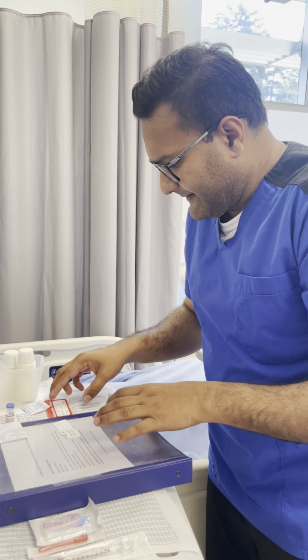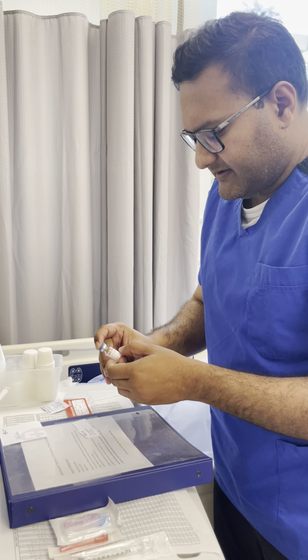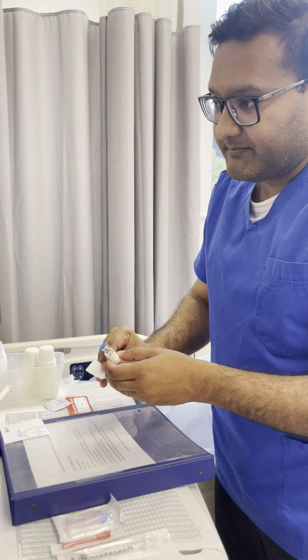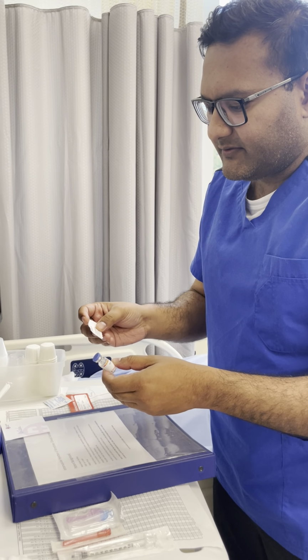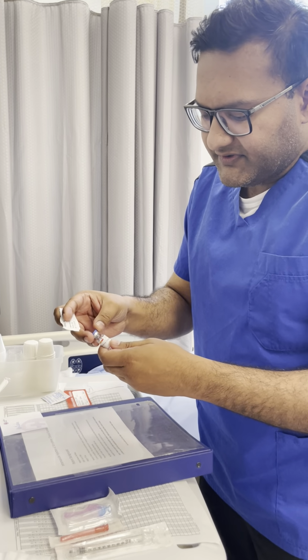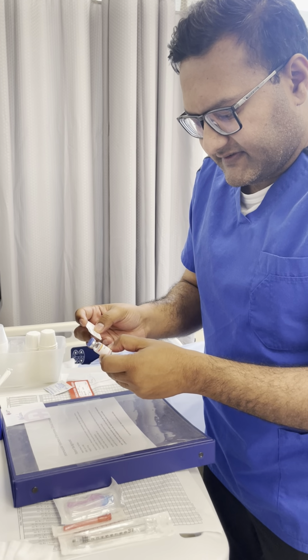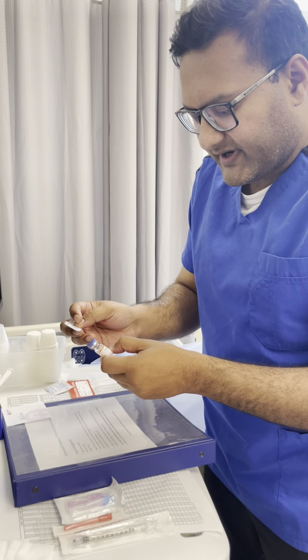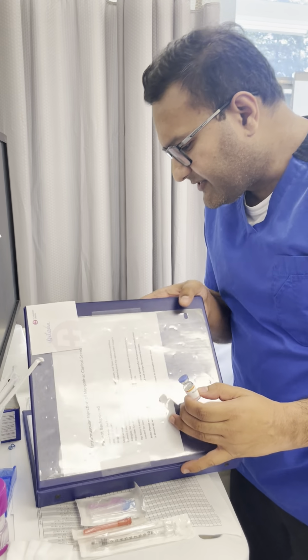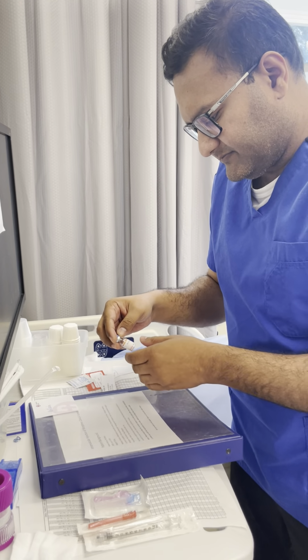So I will now perform the first check. This again will compare the right patient, the right medication, the right route, time, and dose, the date. And I will also check to confirm the expiry. I do see that the medication is not expired. It is the right medication for the right patient. Morphine 10 milligram per ml, Pat Rees. And again, I will compare this with my order. This is intramuscular. And so I've completed my first check.